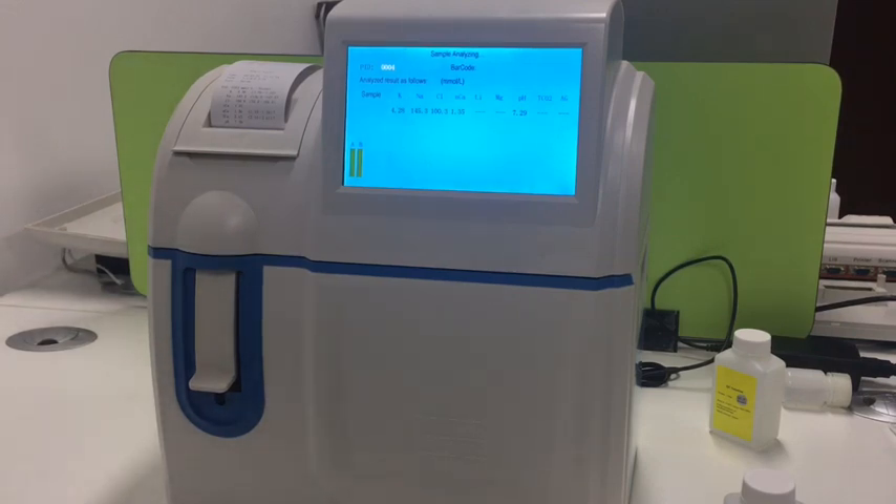It is the same process as testing a patient sample, but the patient uses a real serum sample. Here we just use it to test the stability of the machine, so we use the same solution to test several times.